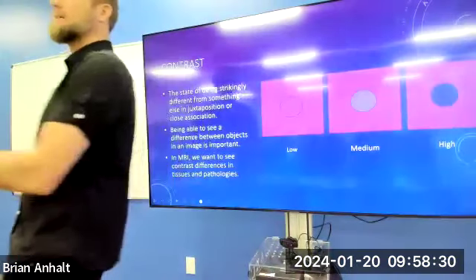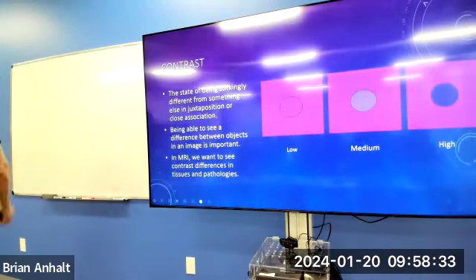That they're contrasting. You say to compare or contrast, you contrast things, you talk about how different they are, right? What are their differences? In imaging, it's the differences in color or shades of gray, because MRI is pretty much just different shades of gray. We have white on one end of the spectrum, black on the other, and all the shades of gray in between.